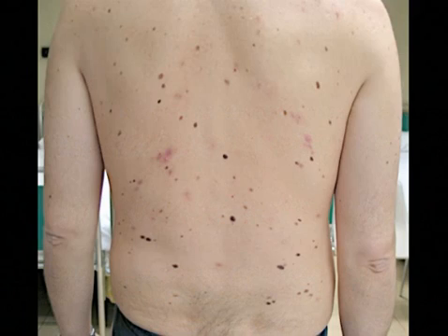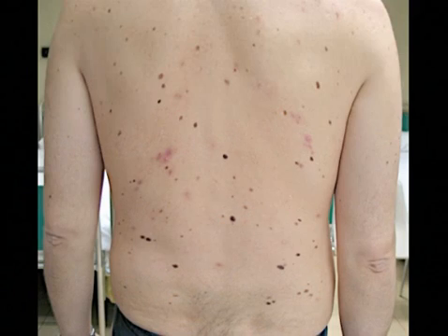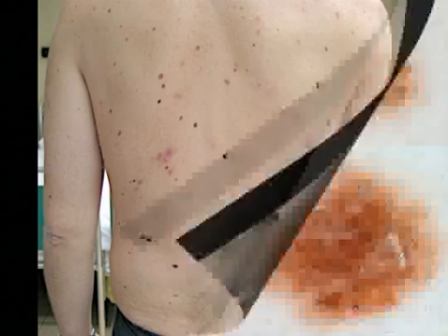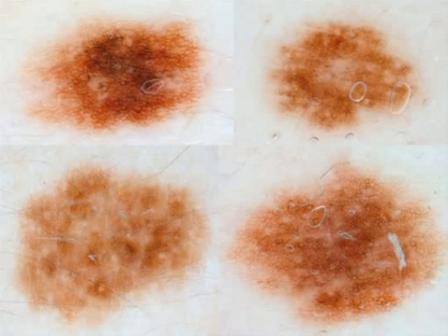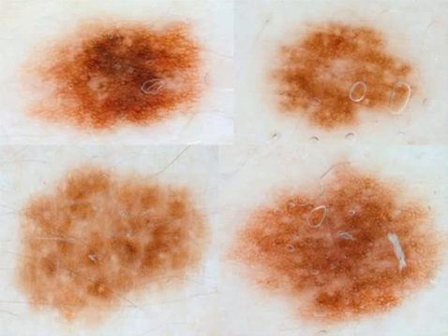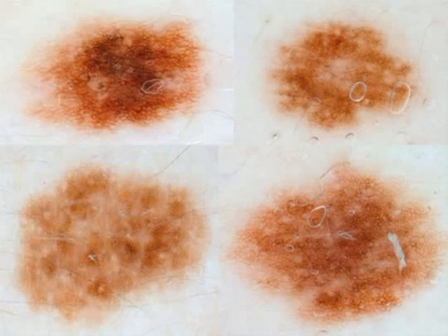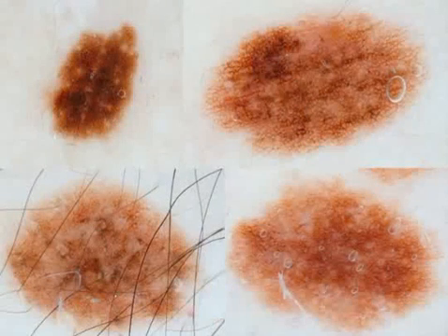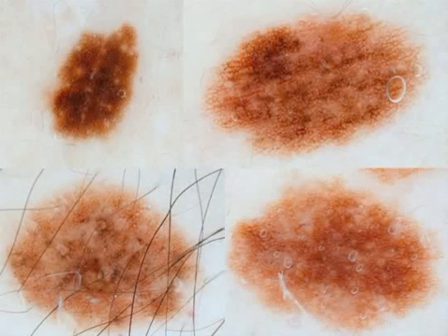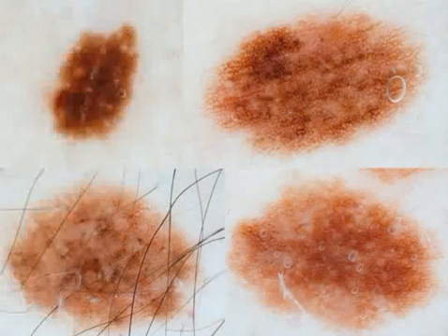Here, a patient with multiple moles. His nevi are all reticular and show various degrees of network irregularity, but these are all different phases of reticular nevi belonging to the spectrum of normality.